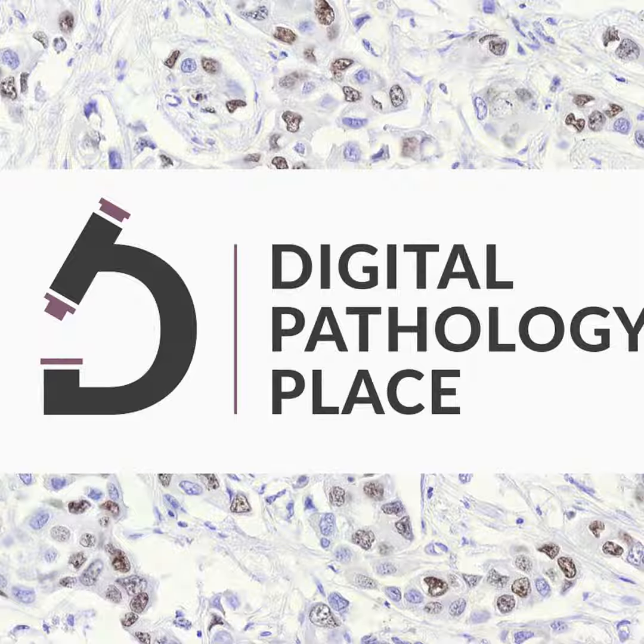That's beyond the scope of our discussion, but basically to me it's natural that pathologists don't look at every single pixel of the image. No, they can't. They only need a confirmation of a suspicion that takes a lot less than scanning the whole thing at 40x.